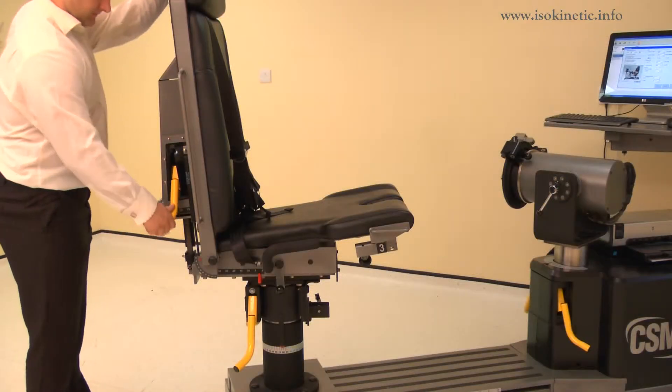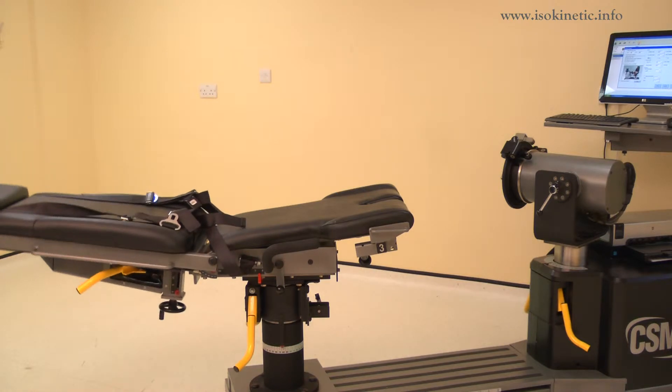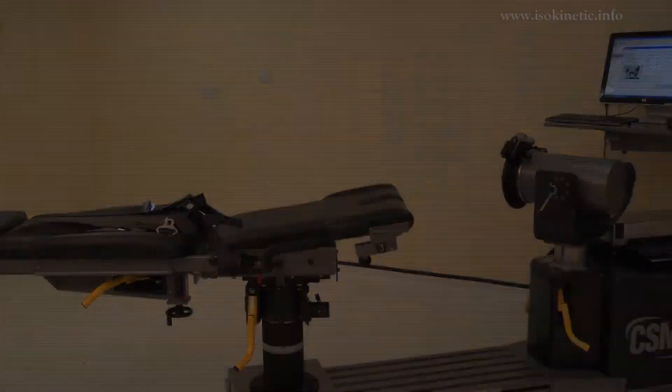To set the chair back angle, lift a locking handle and adjust the chair back. Adjust the back angle to 90 degrees. Ensure both locking handles are pushed down to secure.